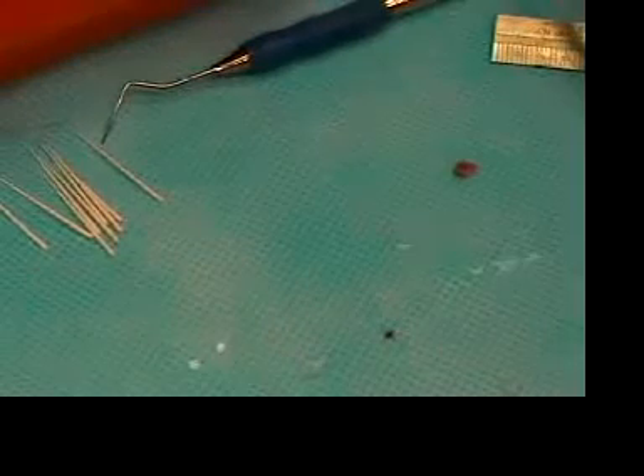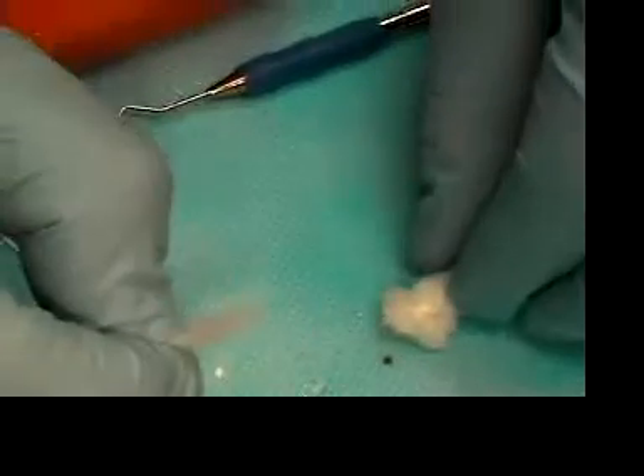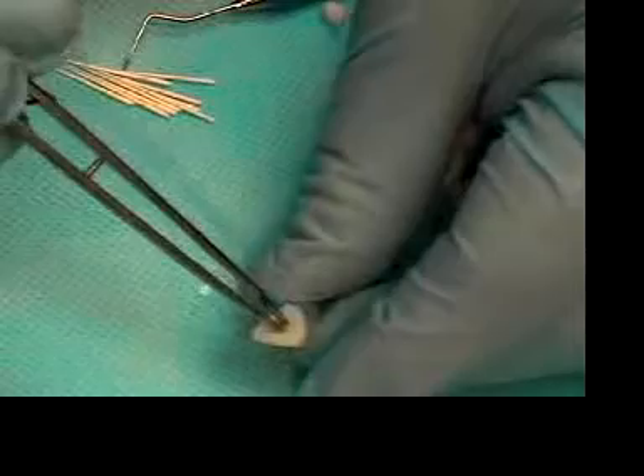There are different ways of drying the canal completely. One way is you can use cotton pellets. If you don't have any cotton pellets, you can make some very quickly just by taking some tufts of cotton off of a cotton roll, rolling them up, and then with the tooth, it's just drying first of all the orifice.